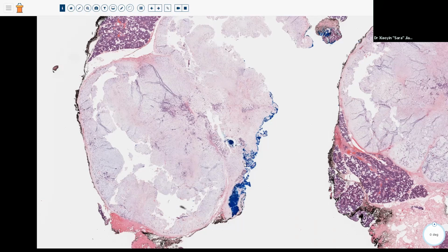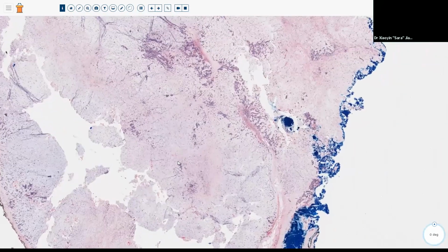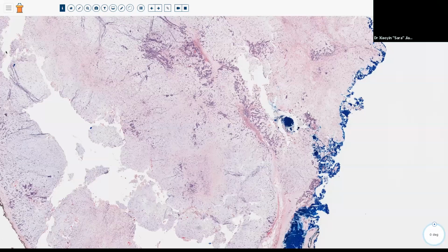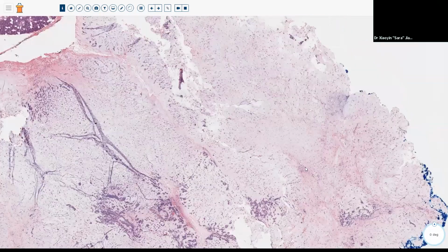In terms of the genetics, these are associated with PLAG1 and HMGA2 mutations. There is an IHC for PLAG1. I don't tend to use it a lot in my practice, but it may be something that you'll come across in yours.